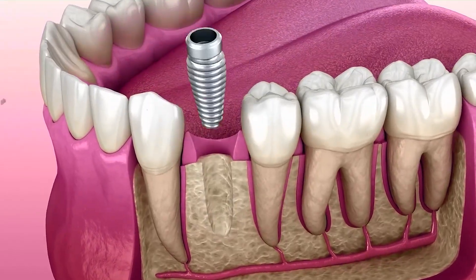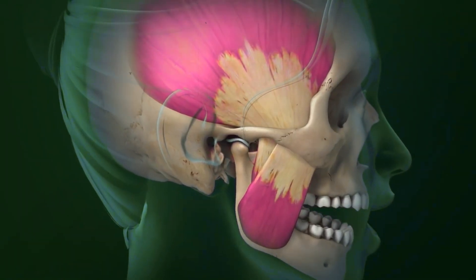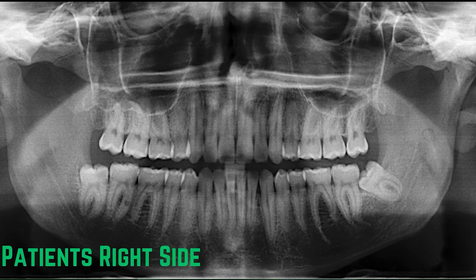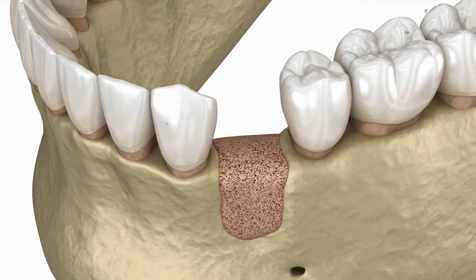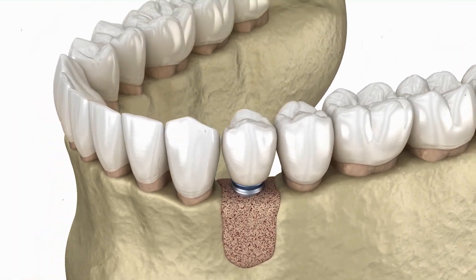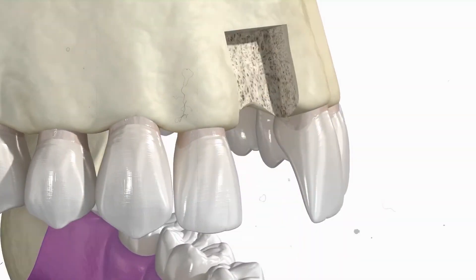When you want to get a dental implant, the doctor first examines your jawbone using an x-ray. This is important because a strong jawbone is essential for the stability of a dental implant. If your jawbone is weak, the doctor may recommend a jawbone graft.